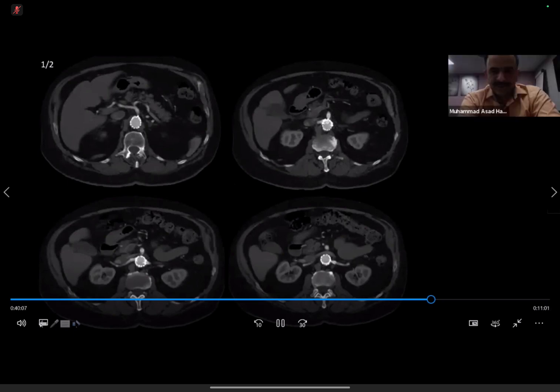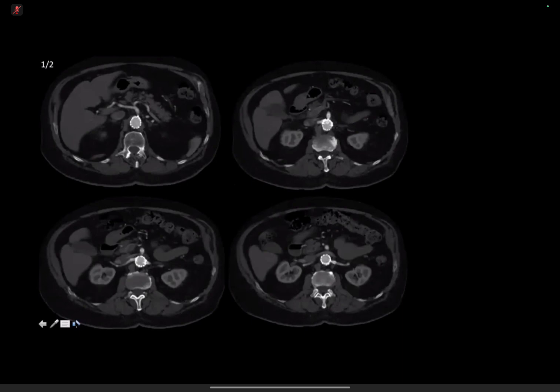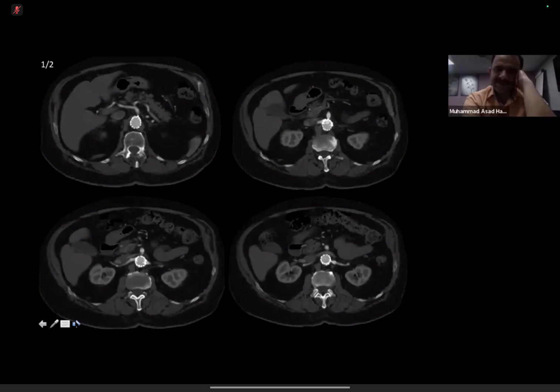Okay. The satisfactory appearance of the kidneys. There's some possible calcification in the left renal artery, but both kidneys appear to enhance normally. The celiac axis also appears to be enhancing normally. I cannot see any abnormality in the liver or pancreas in this phase of imaging. The small bowel, I think there's some small bowel in the lower images which appear slightly featureless. Bowel is normal. Just concentrate on the vessels.